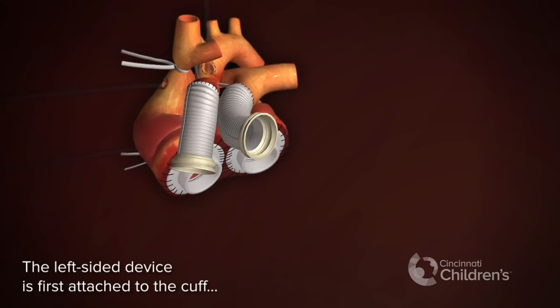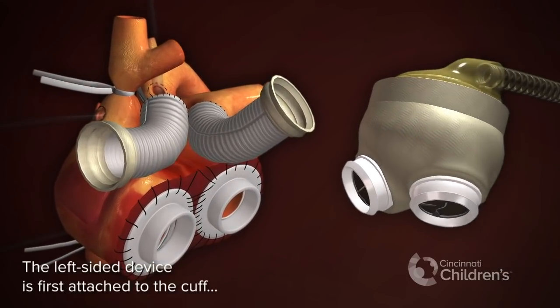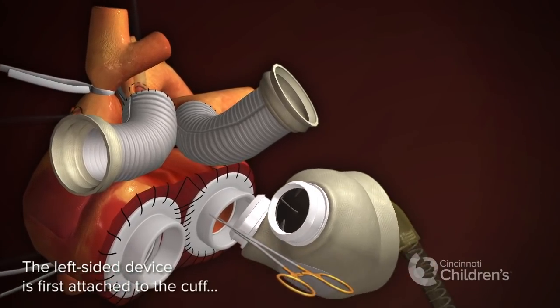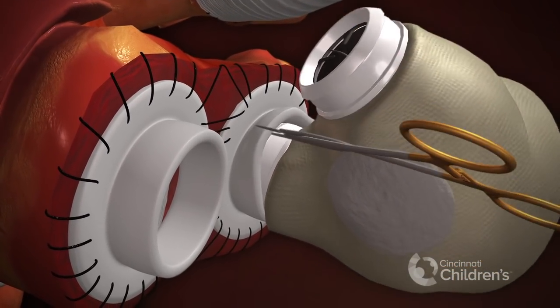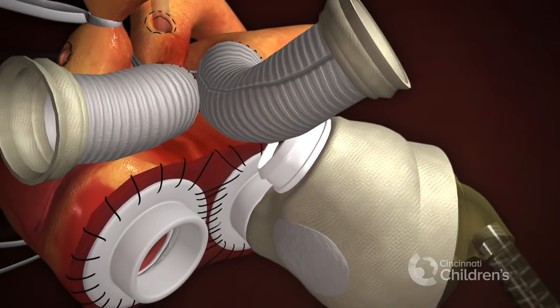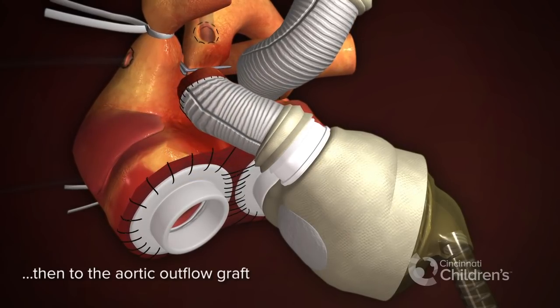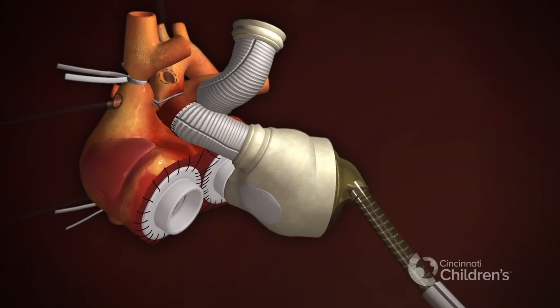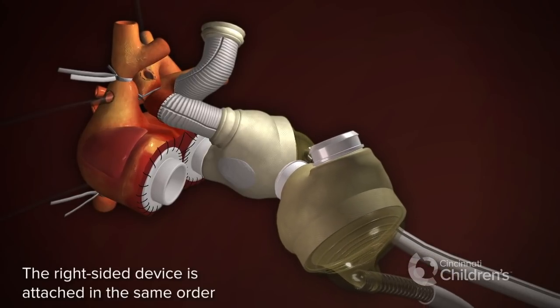The left-sided device is first attached to the cuff with the assistance of needle drivers at 10 and 2 o'clock. Then the aortic outflow graft is positioned over the outflow cap. The right-sided device is attached in the same order.